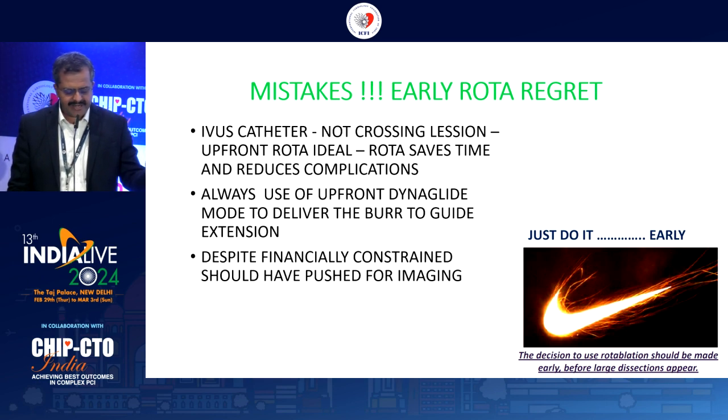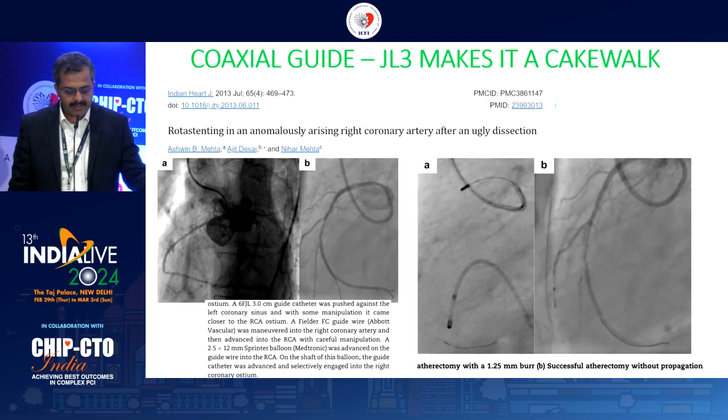Probably we went with the Dynaglide mode, but somehow it still got stuck in the guide extension. And this has been described. Dr. A.B. Mehta has described anomalous right coronary artery from the left side with a JL guide, but this was typically not from the high left sinus.